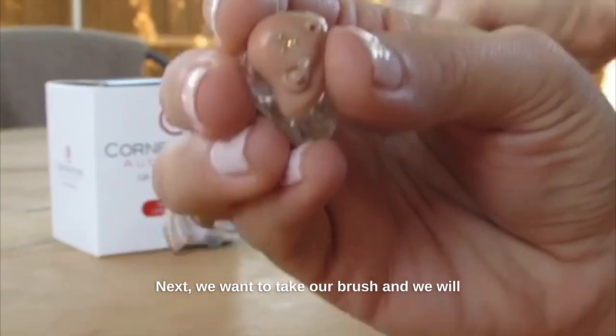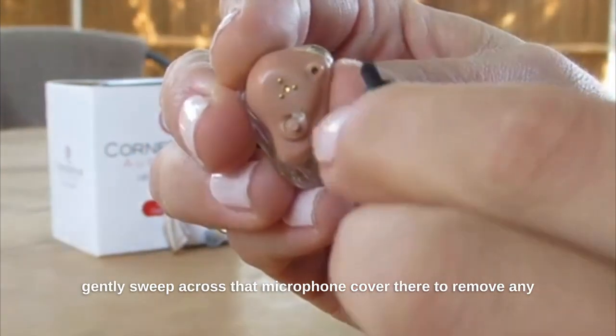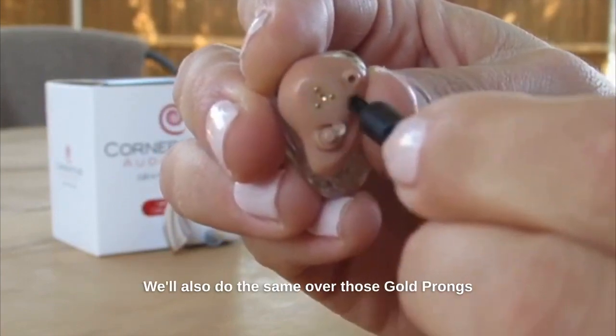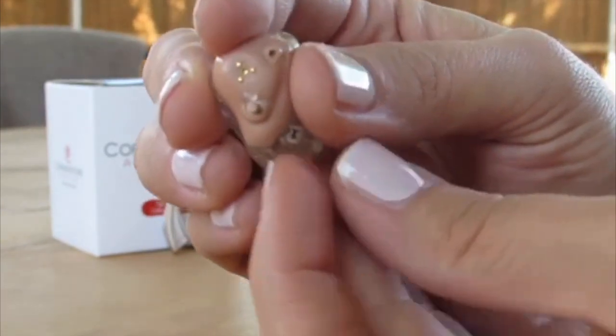Next, we want to take our brush and we will gently sweep across that microphone cover there to remove any dirt and debris and buildup from the hearing aid. We'll also do the same over those gold prongs to make sure charging is at its best.